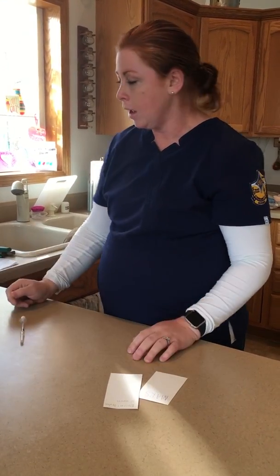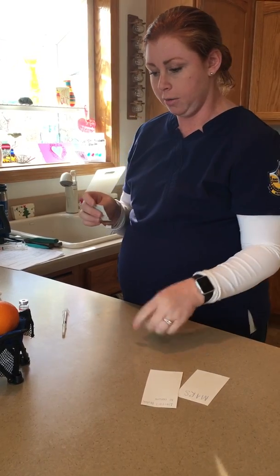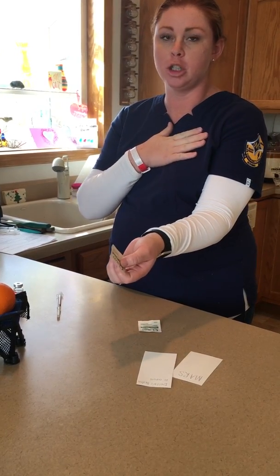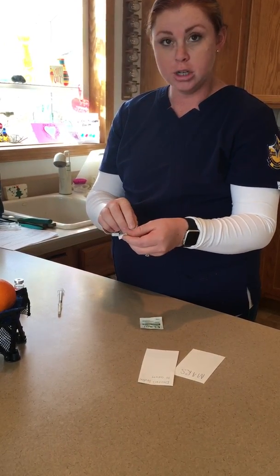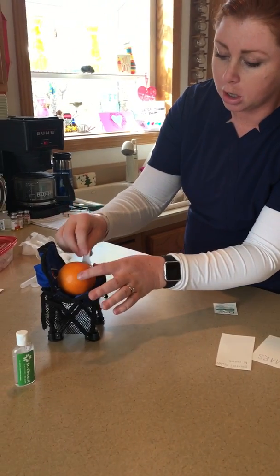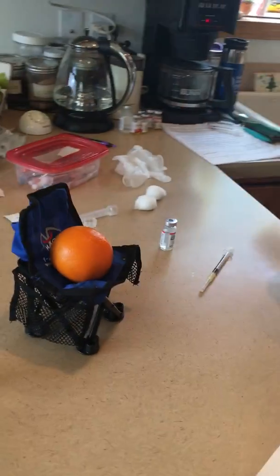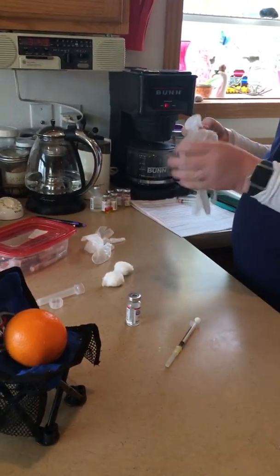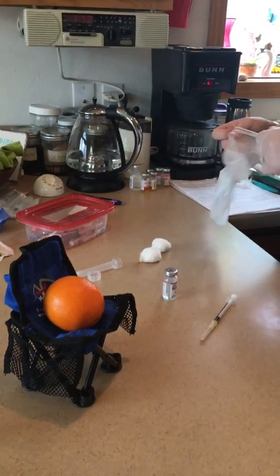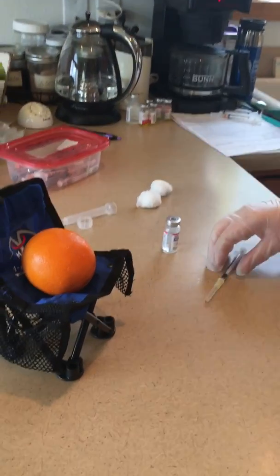Now I'm going to wash my hands really good, and for this patient, since they're sitting comfortably in a chair, we're going to use their inner arm right here. You can also use their upper chest or upper back if you're doing allergy testing or anything like that. I'm going to prep my injection site. I'm going to start right here and work my way out, and while that's drying, put my gloves on. So I get my gloves on and that's good and dry.